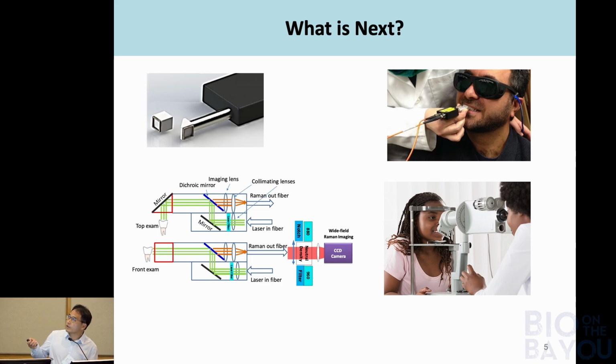In case that approach doesn't go as well, we will propose another approach where fibers are not used. You can set up a stage where the patient puts the chin on the table of the stage. Then we can have a probe moving on a track, and bring it close to the mouth for the same purpose. So that's the idea for the next step.